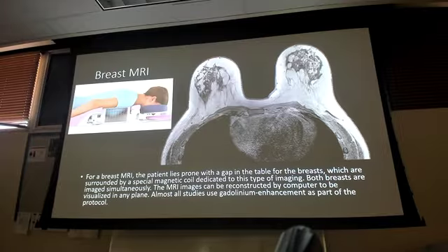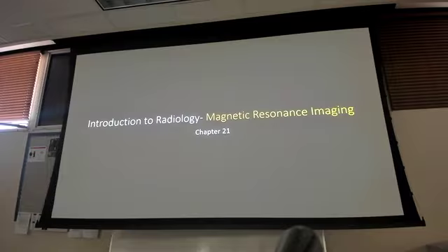So the biggest thing is, implant patients still get mammograms. They still follow the screening mammogram rules, they still follow the diagnostic mammogram rules. Unless you are concerned for a rupture of a silicone breast implant or a loss of integrity, a leak, a rupture, whatever you wanna call it, that gets a breast MRI.